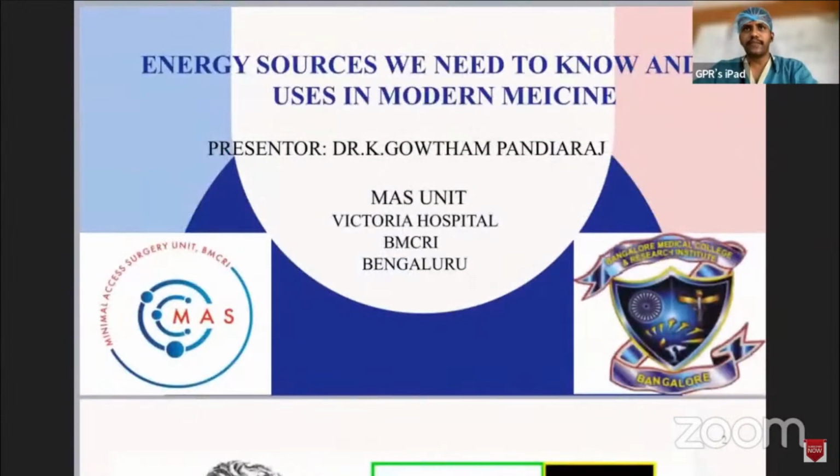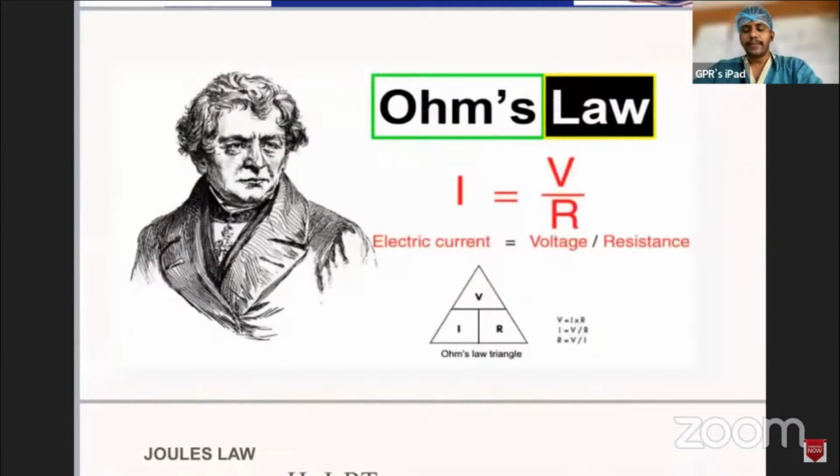So tissues like fat, compared to nervous tissue, transmit current in a much lesser manner. We have to understand this before we go into anything else. The base of current, or the electric charge, happens in two different forms: either direct current or alternating current. Alternating current is nothing but the spikes as well as the breaks of the wave, so that it has its upside and downside in a sinusoidal fashion. Whereas a direct current flows in a unidirectional fashion, and it has its own advantages and disadvantages.